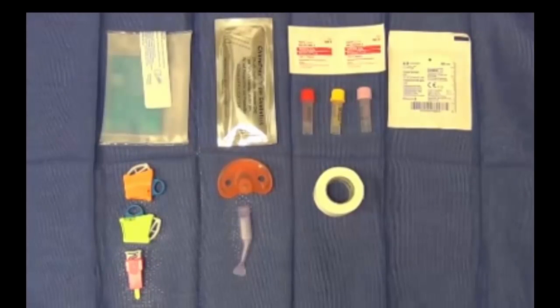Chloroprep, betadine, or alcohol swabs are typically used to cleanse the area prior to lancing the heel. The agent utilized will depend upon the institutional guidelines. You will also need appropriate blood collection microtainers or capillary blood tubing. A piece of gauze is used to wipe away the initial drop of blood and to tamponade the hemorrhage when the sampling is complete. A pacifier and sucrose solution are used for pain control measures.